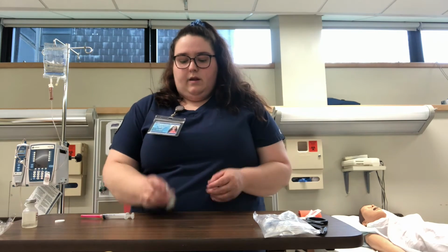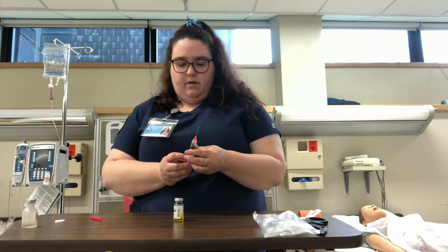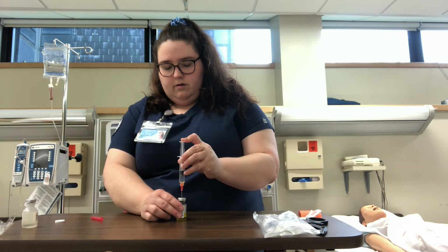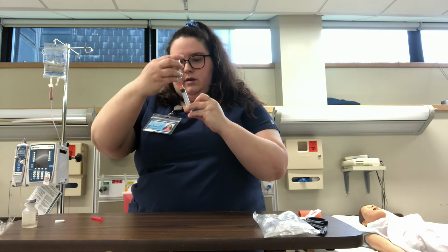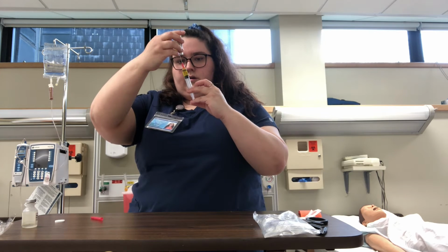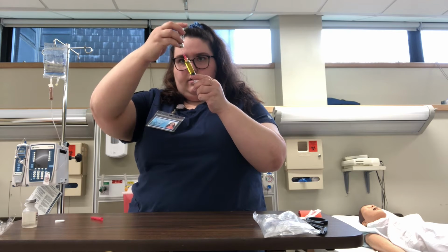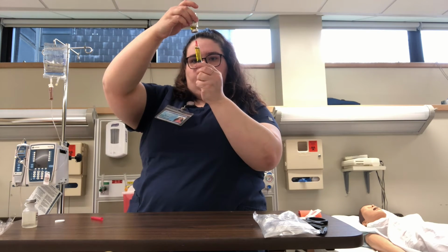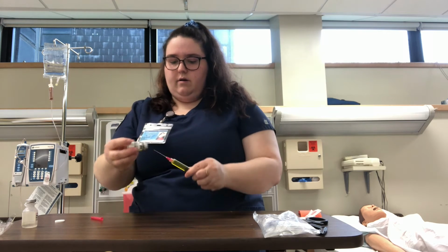Okay. Now that my medication is mixed up, I'm going to take my syringe, pull up 5 of air, push the air in, and then take out 5, the medication.